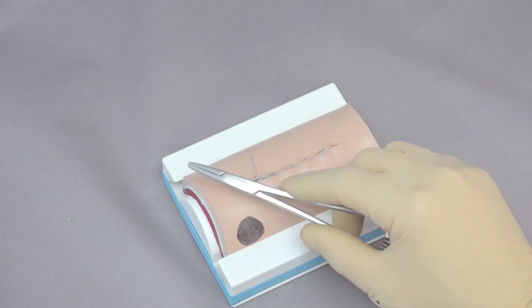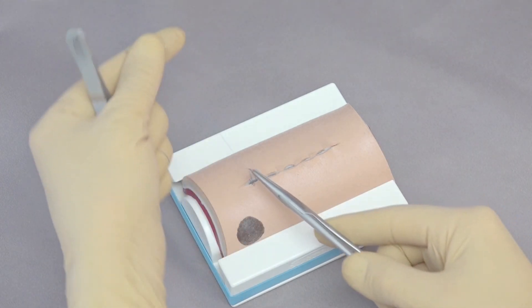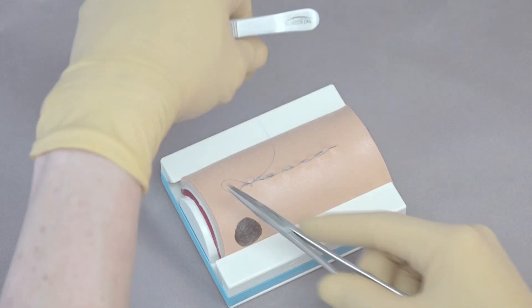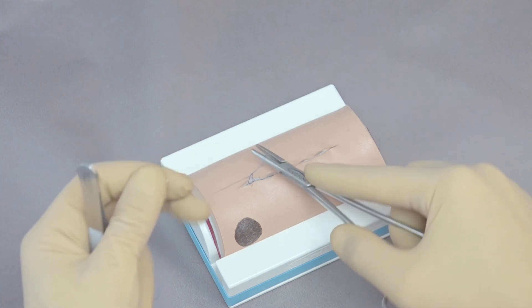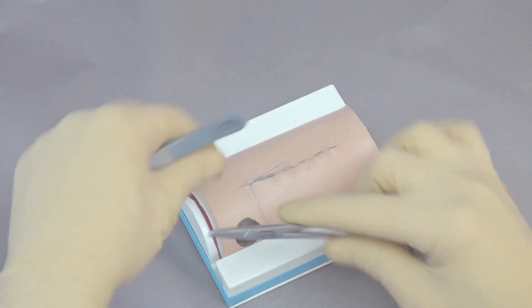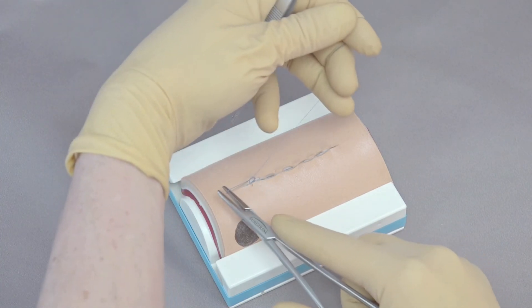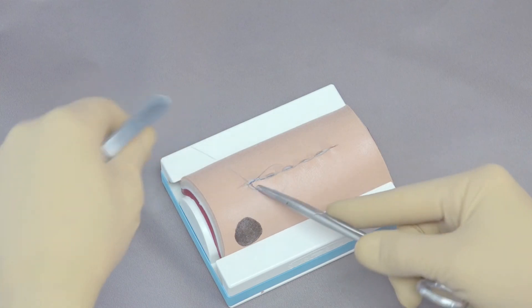So we're going to go superficial to deep and come out right where the other sutures do. So now as we look at this, all three of these suture loops are coming from the depths of the incision. And we do a square knot, needle holders in the middle, come around once, tighten it down. And as we tighten, we're going to tighten along the incision. You can see how that pulls it together. Come around here once, tighten, back through. Make sure we're keeping it nice and flat and tighten. And then one last throw to tighten that up.